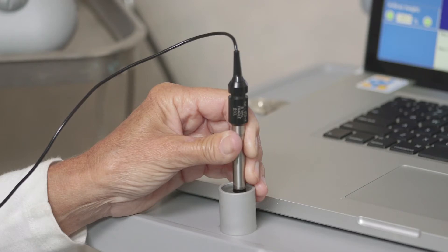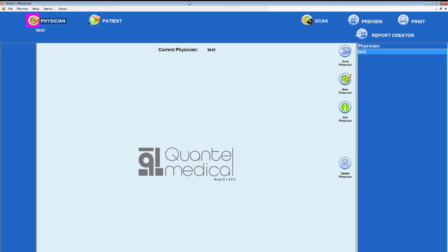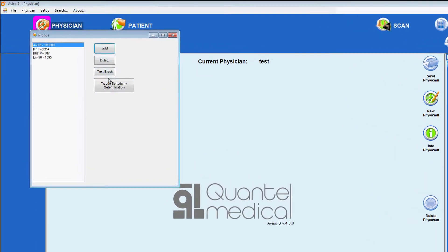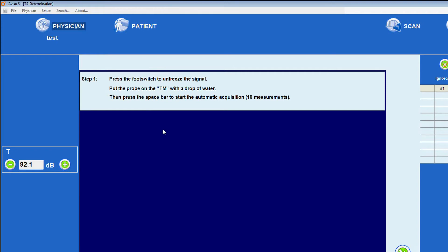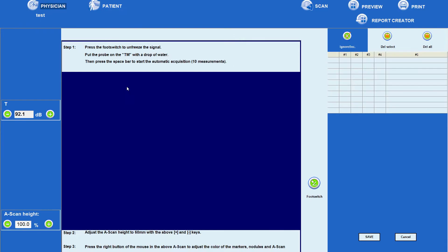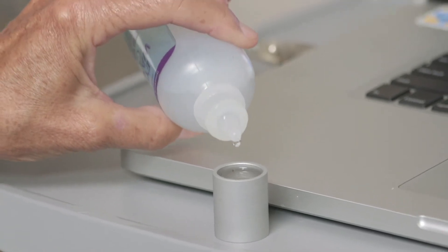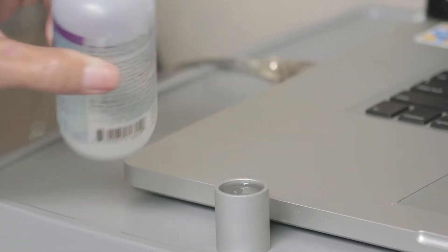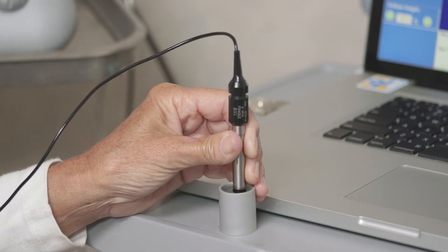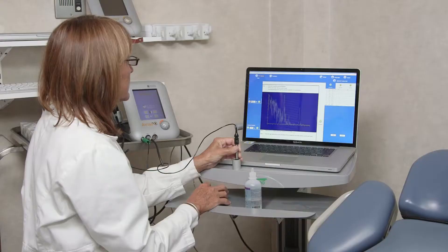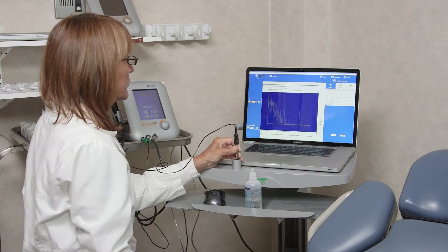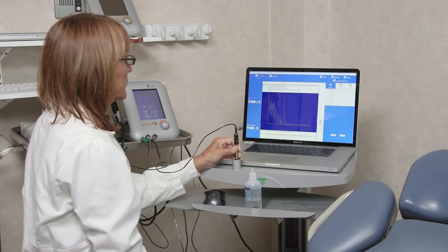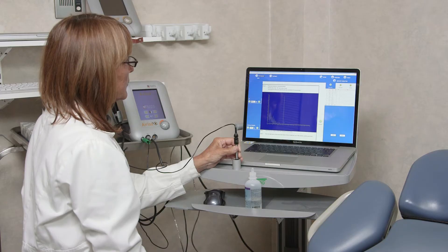To determine tissue sensitivity for a given probe using the Aviso-S platform, select the appropriate probe on the computer screen menu and choose Tissue Sensitivity Determination. Tissue sensitivity can be determined automatically or manually. First, place a drop of water onto the tissue model, then position the probe perpendicular to its surface and press the keyboard's space bar to initiate the automatic acquisition of 10 measurements.